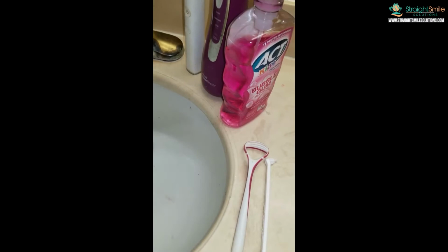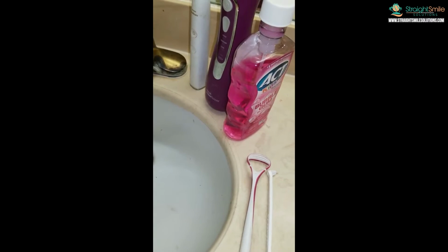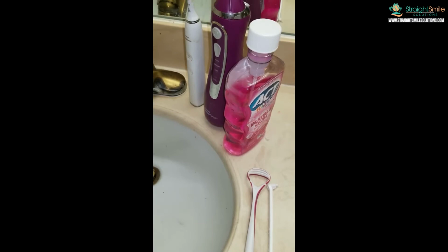A tongue scraper and a tiny little itty bitty toothbrush as well to get into those crevices. Of course, floss as well. I don't know why that's not here. But in any case, these are the things we like.